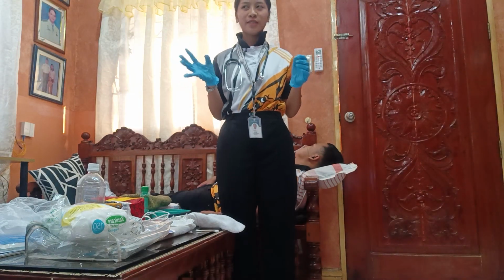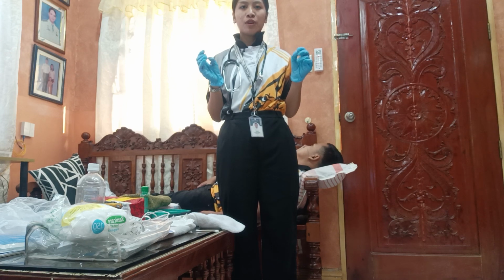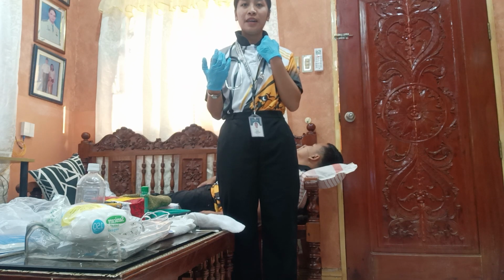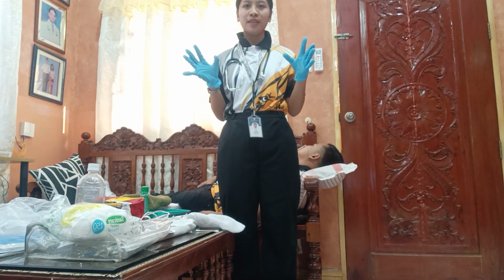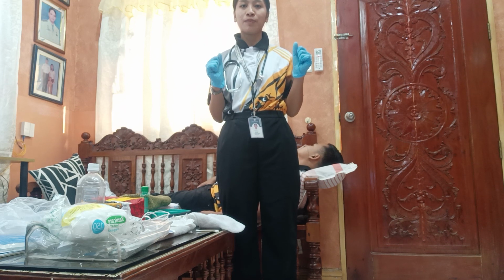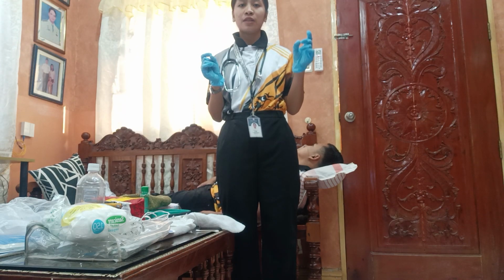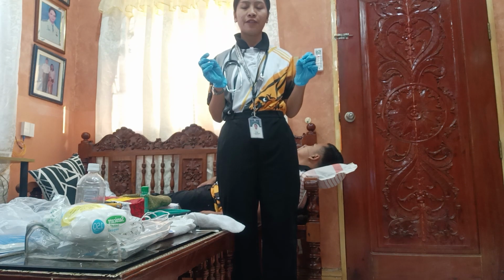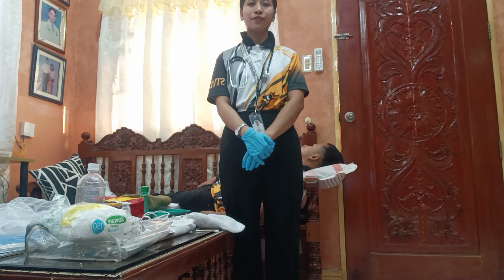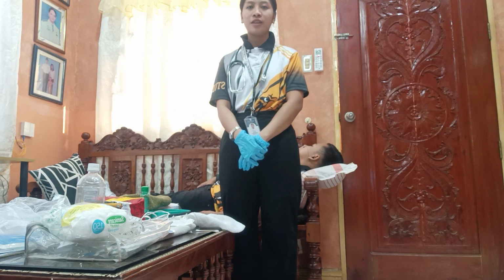Oral hygiene po is ikikip po yung mouth clean, and most is promote comfort and reduce thirst. And also, last po is remove the equipment and return the patient to a position of comfort, and remove gloves, and also raise the side rail and lower the bed. Promotes patient's comfort and safety. Removing gloves properly reduces the risk of infection, transmission, and contamination of the other items.